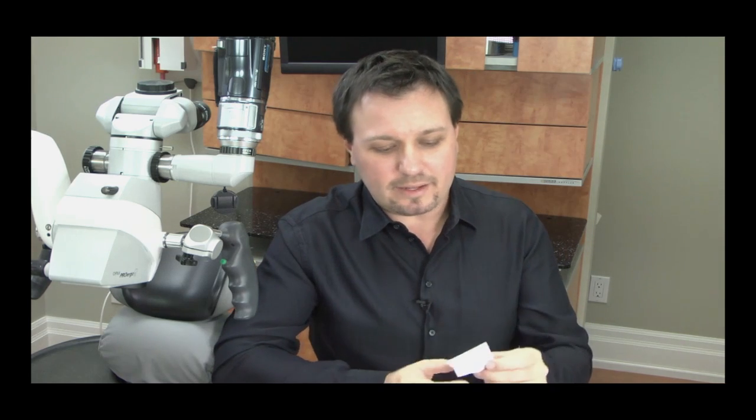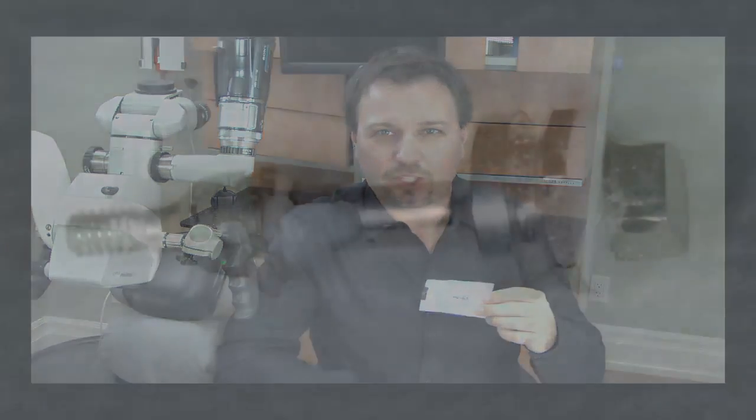I actually have it right here — I've bagged it so it was sterilized — and I've taken some pictures of it. I'm going to put the pictures up so you can see how everything was locked together. The driver is probably not much good anymore; you could maybe melt the composite and re-clean it, but it's probably done. That's just the price of getting the component off.